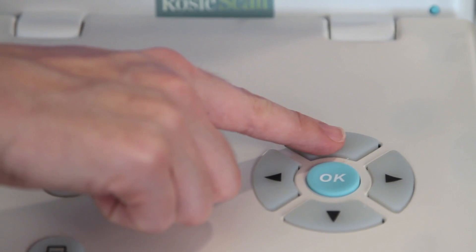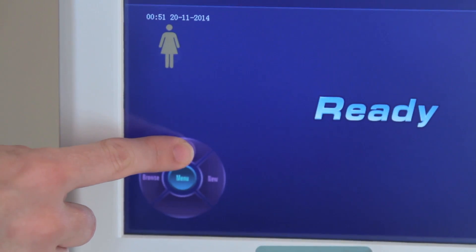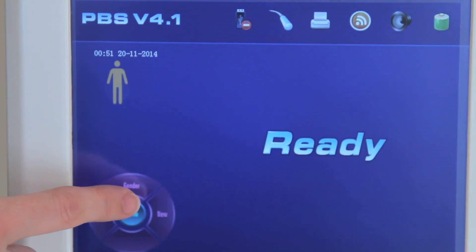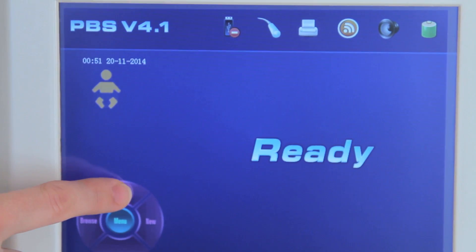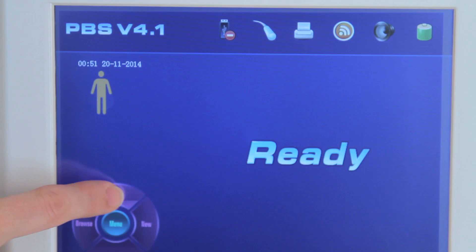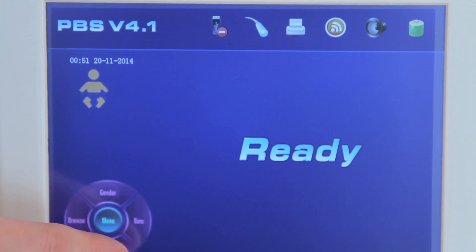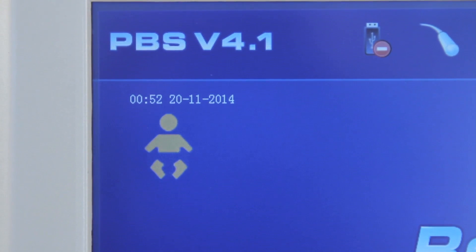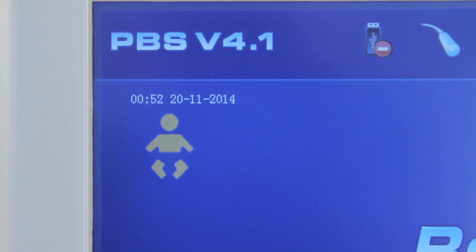Press the up directional key or touch the gender functional key to select gender. Select the male icon for male, the female icon for female, and the baby icon for pediatric. Pediatric mode is only effective to measure volumes that are less than 100 ml.